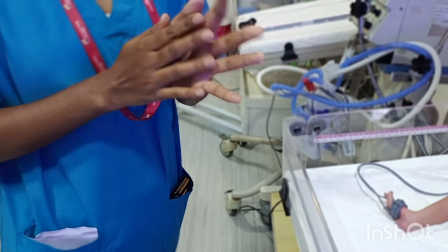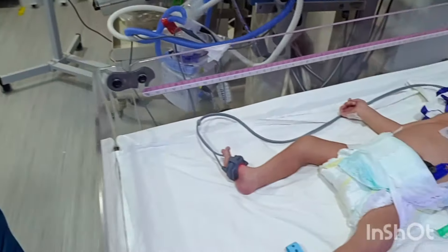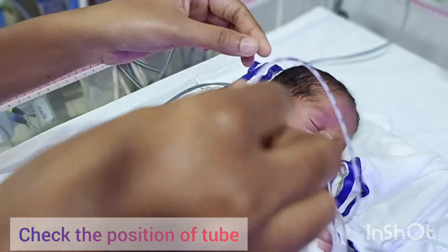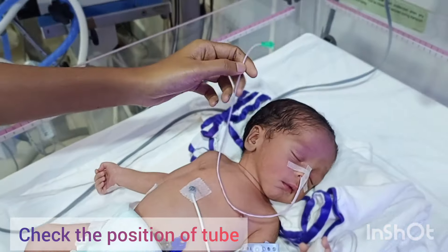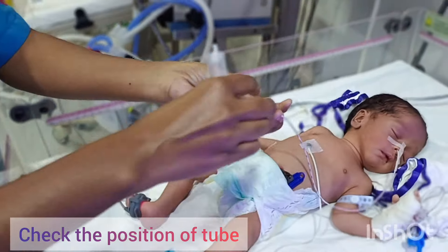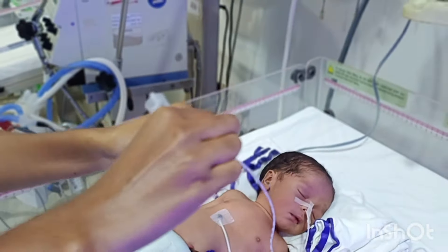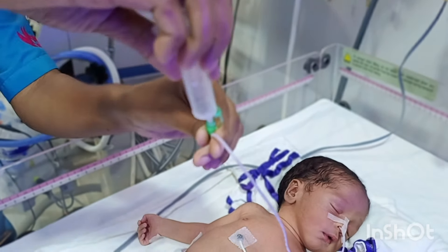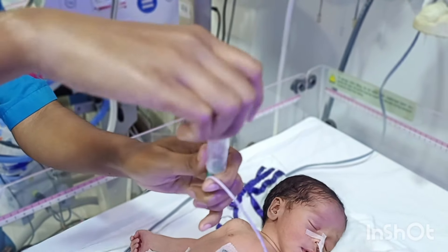Once hand sanitation is complete, we have to check first whether the tube is in position or not — whether it is properly secured to the baby's nose and whether it has not come out. We have to check that. Now we have to open the end of the tube and attach a sterile syringe.